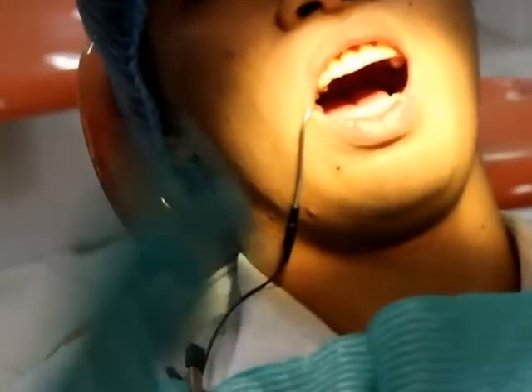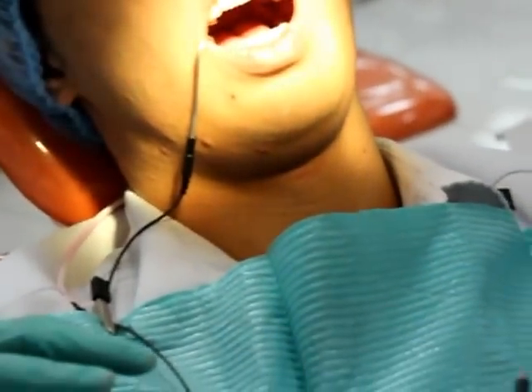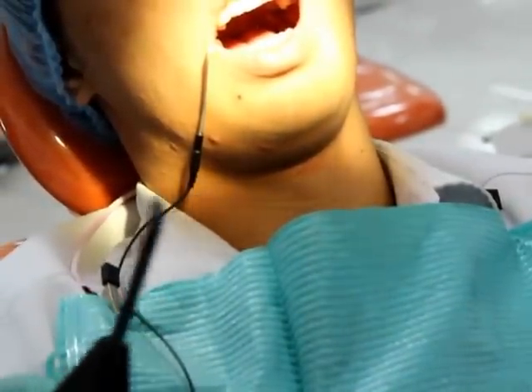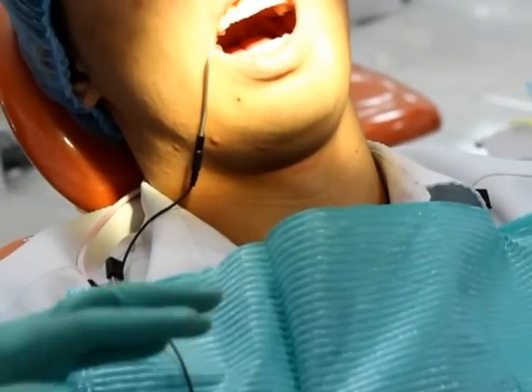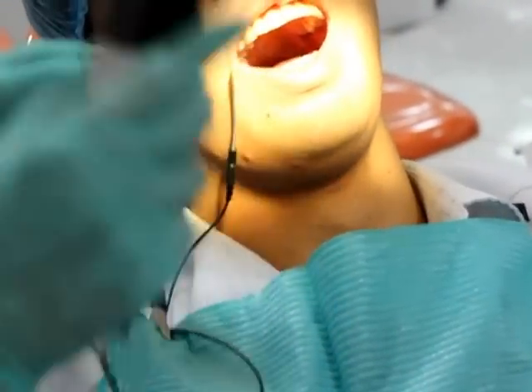And then instruction again. I will put something on your tooth. Once you feel it, raise your right hand. But actually, even if the patient does not raise the right hand, the patient will just jerk, so you stop. Example muna.